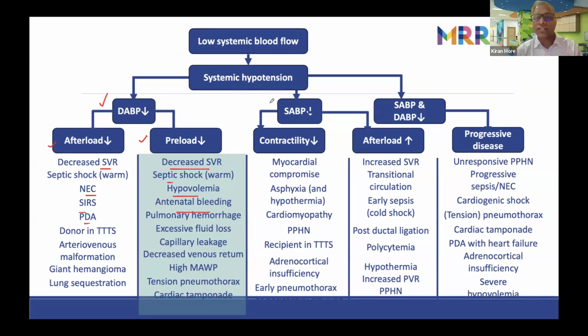If your systolics are low, then I will go on the echo and find out what the problem is. The first thing I will look at is the contractility actually, and second will be the afterload. So what sudden increase in the afterload will cause shock? The babies going into cold shock, with very high SVR.